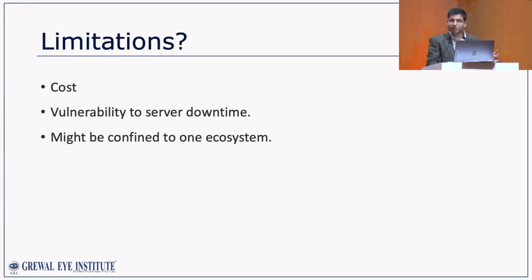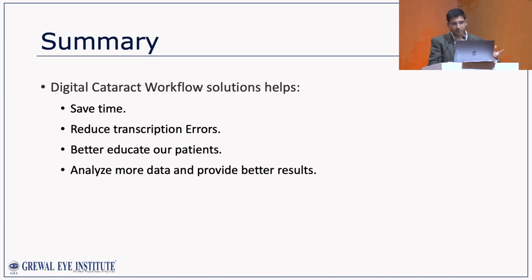So, limitations: cost, but this is not a true limitation. If you look at the larger picture, you will actually end up saving in the long run. But yes, there is vulnerability in technology to server downtime. And yes, if you invest in this, you would be confined to one ecosystem. But I will strongly recommend this is the future. Our patients deserve this. We need to transition to this, to help save time, errors, and provide better outcomes and experiences for our patients.